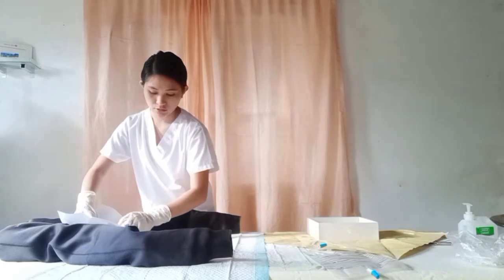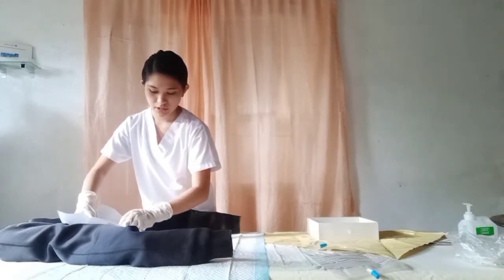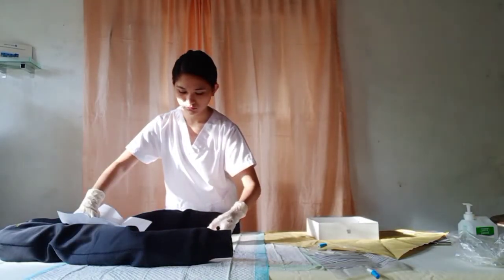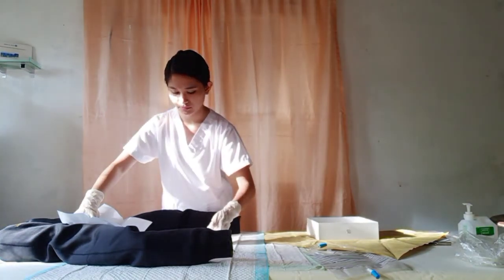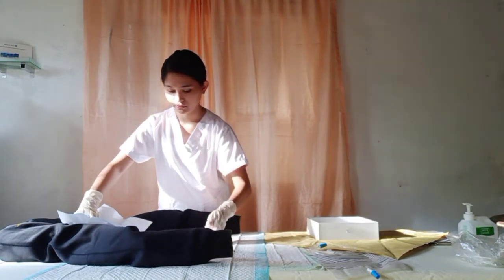When you see that the urine flows, advance 2 inches, then inflate the balloon. You can feel pressure inside, but it is okay. Please tell me if you are feeling discomfort.